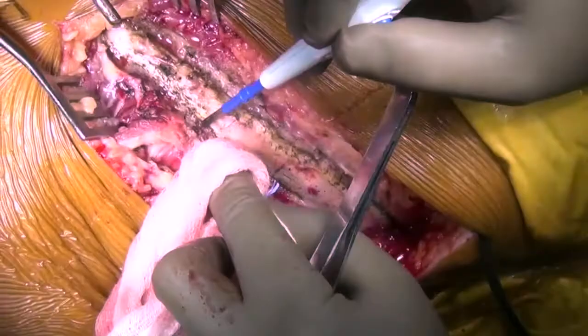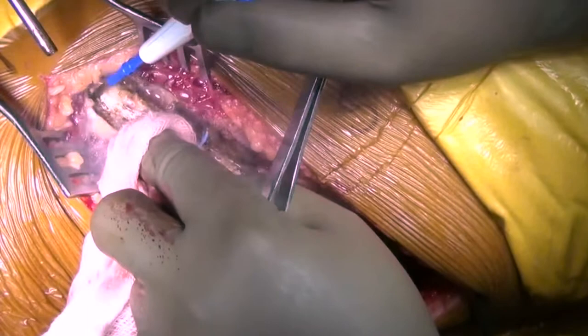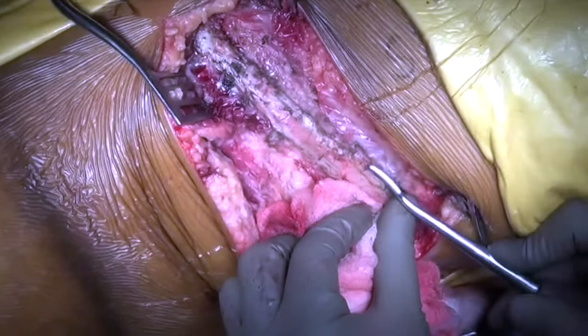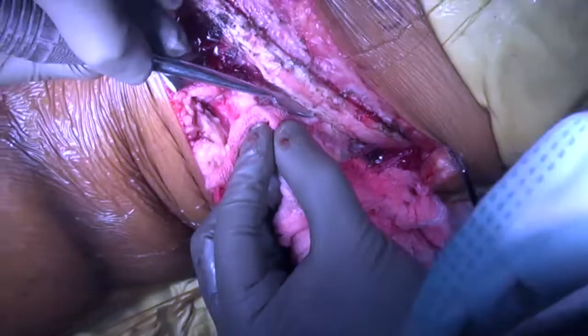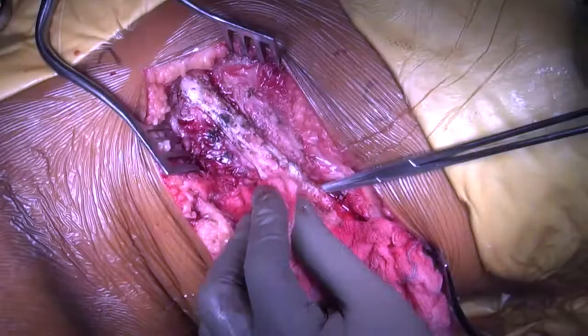After adequately exposing the rib you need to dissect it off the underlying periosteum. I am demarcating the lower margin of the rib, which is slightly pointed, separating it from the intercostal vessels and intercostal nerve. Making sure the entire margins of the rib are released is very important to separate the rib from the underlying structures and pleura, avoiding damage to the lung tissue. The meticulous dissection must continue on the undersurface of the rib, proximally and distally, keeping the periosteum flush to the lower margin of the rib to avoid injuring the neurovascular bundle.